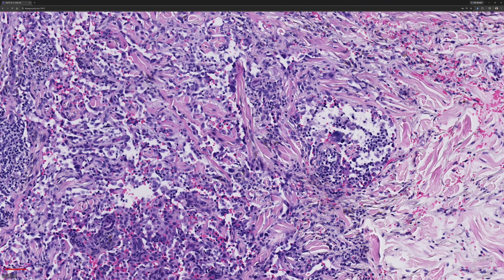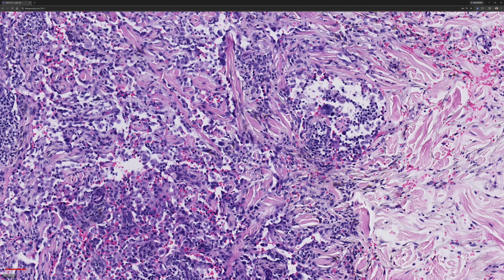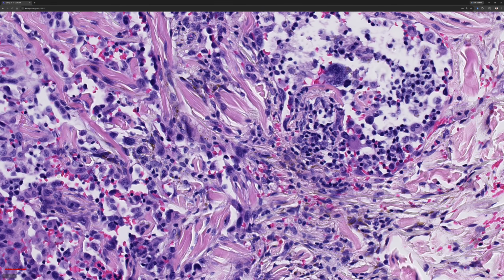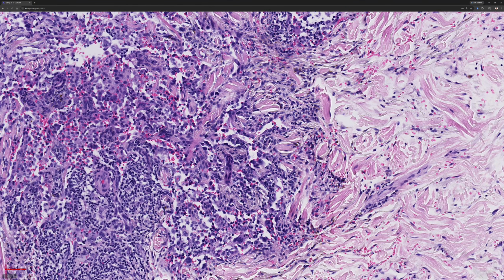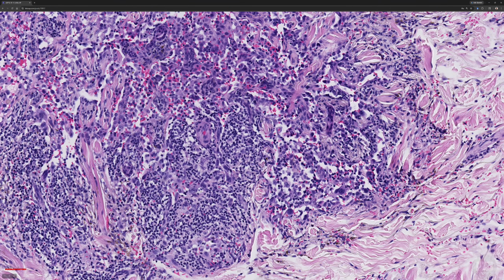Now, there are other things that can do that. Remember the case of a Masson tumor, papillary endothelial hyperplasia, a lot like this pattern, right? But without the pleomorphism. And that was inside a pre-existing vascular channel, which is reassuring. This is actually in the dermis, infiltrating between reticular dermal collagen bundles. That's bad. That's why it's really important to try to recognize that background vascular channel in papillary endothelial hyperplasia. Because angiosarcomas, surprisingly, almost never grow inside the lumen of a vessel.